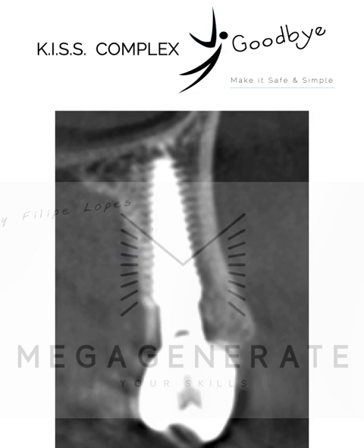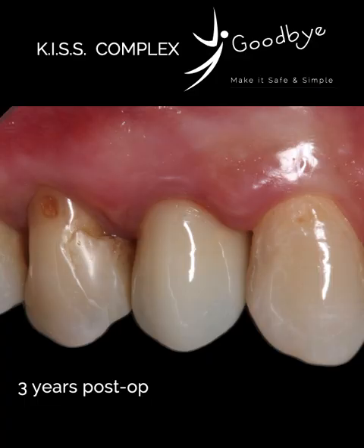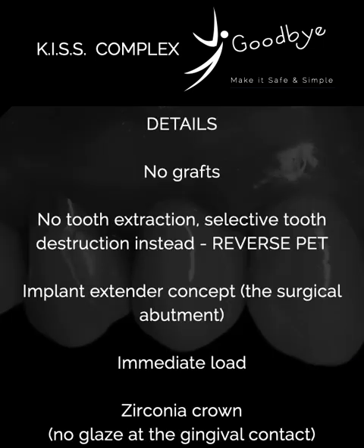And this is the post-op CBCT at 3 years. This is 3 years post-op. You got your final crown in, and you got this beautiful gingival contour, despite not having a very cooperative patient. But despite that, you have created natural surrounding conditions that allow you to finish the case like this.